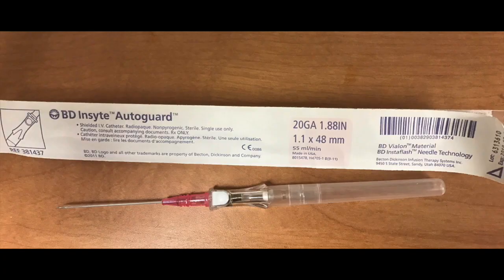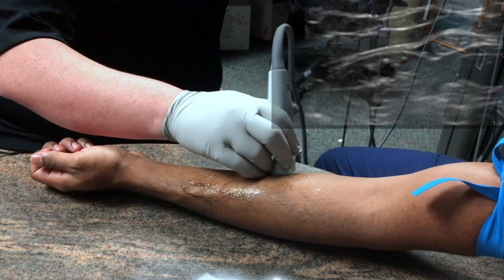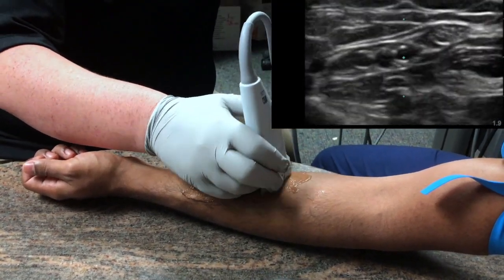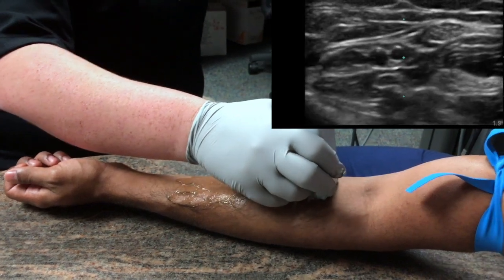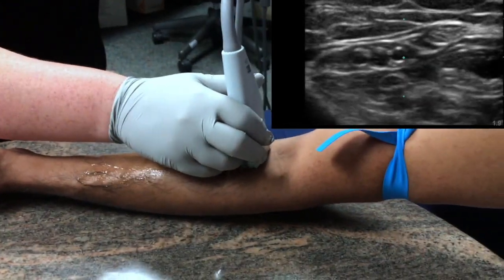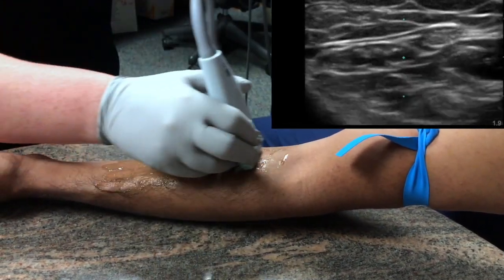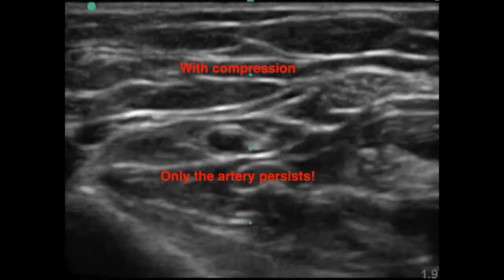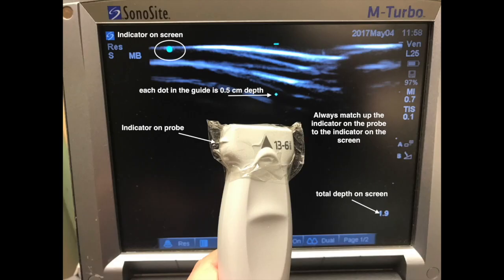Ideally use a long IV catheter as the veins you will aim for tend to be too deep for traditional catheters. Second, locate the best vein for cannulation using a linear array probe. In general, try to use the veins of the forearm as they tend not to blow. Be sure you are using a patent vein. Veins compress easily while arteries are more round, pulsatile, and more difficult to compress. Measure the depth of the vein using the guide on the screen. Ideally use the biggest, most shallow vein you can find, but don't go below 1.5 cm or you run out of catheter before you hit the vein. Always make sure your probe indicator matches your screen indicator to help you redirect your needle if you break the skin to the side of the vein.